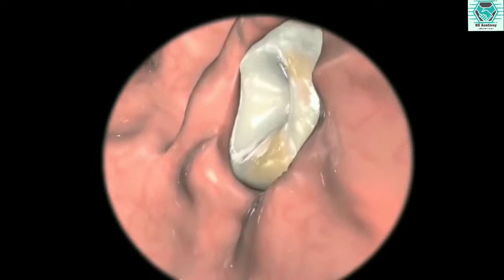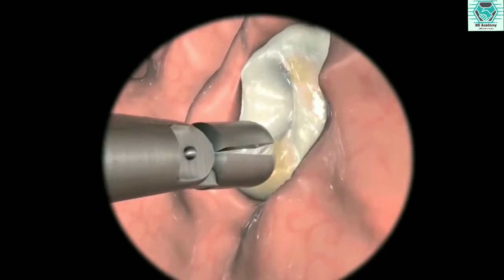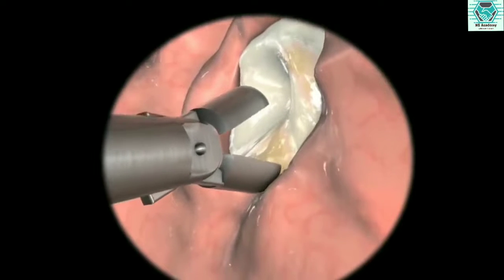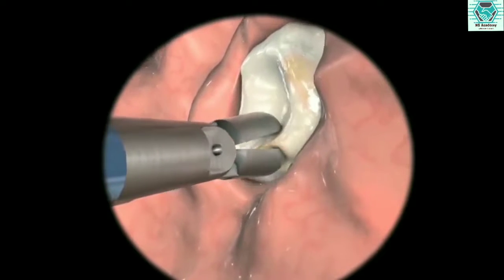So in the video we can see this. Remove things such as food that may be stuck in the upper GI tract. Inject air or fluid. Stop bleeding. So these things are done.